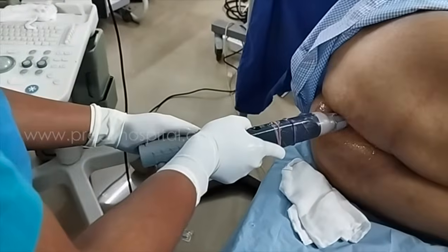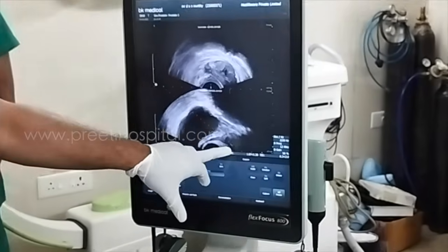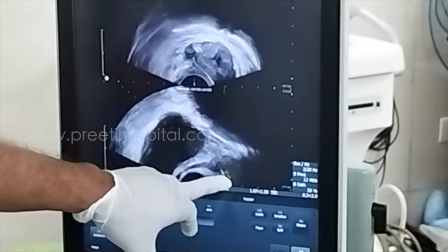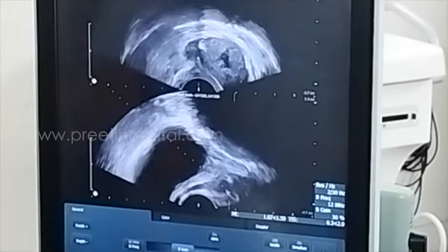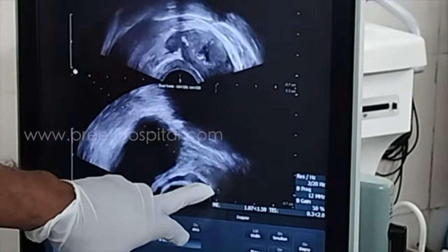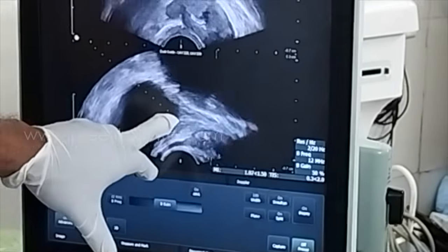Now, how will you see whether the prostate is touching here? Here you can feel. And here also you can see the needle is coming here. Yes, this is the base level. A small amount will be there. You are in the periphery. Can you fire? See, don't remove. See, almost it has the base level, mucosa, periphery, and up to the bladder it has gone.